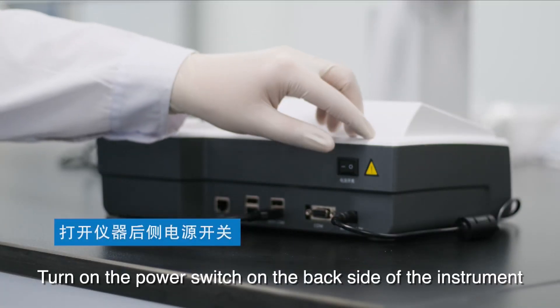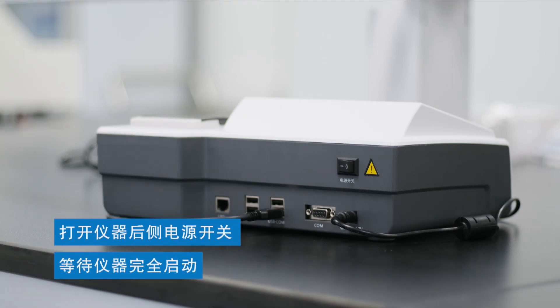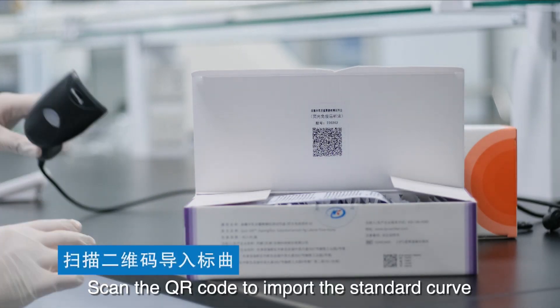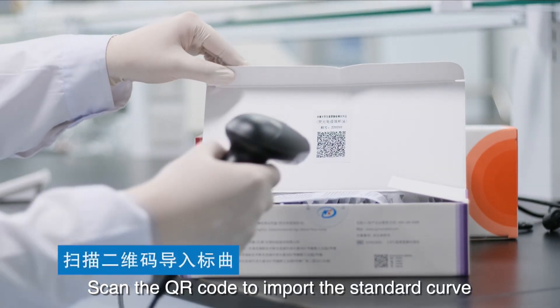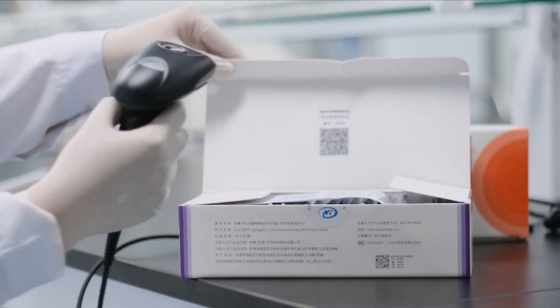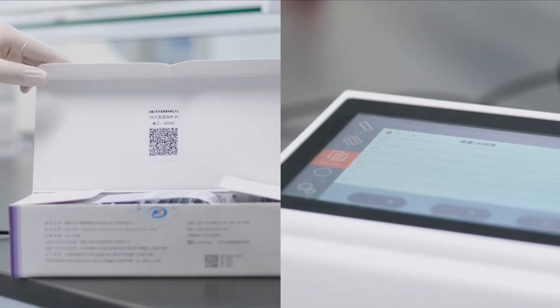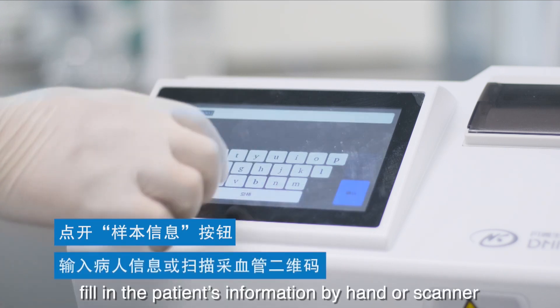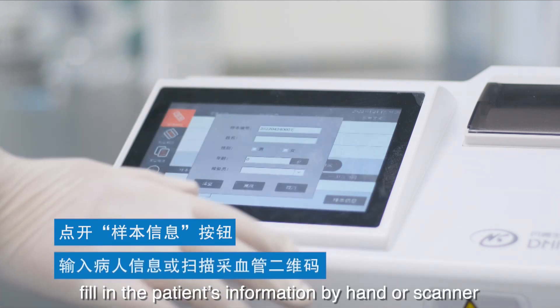Turn on the power switch on the back side of the instrument. Scan the QR code to import the standard curve. Click sample info and fill in the patient's information by hand or scanner.